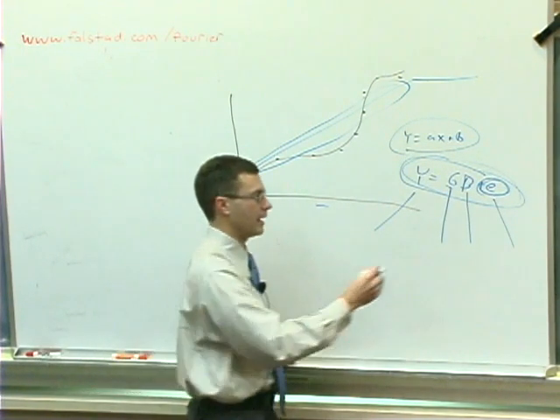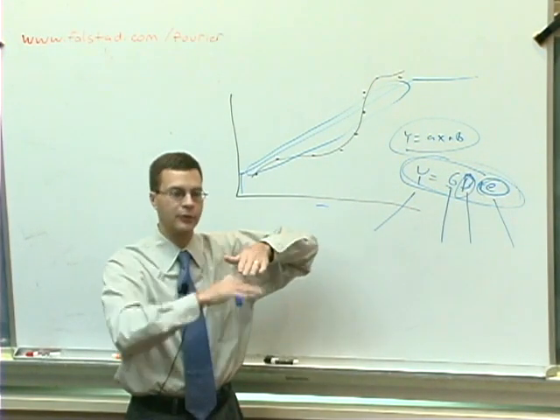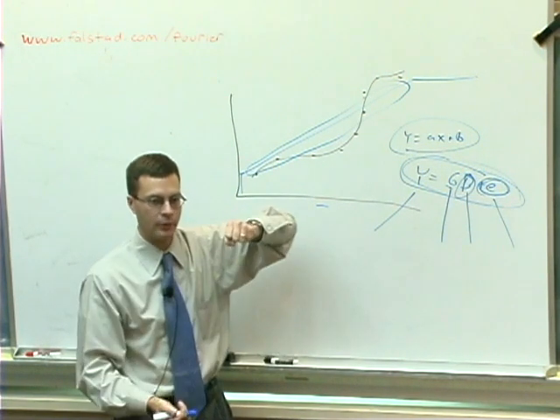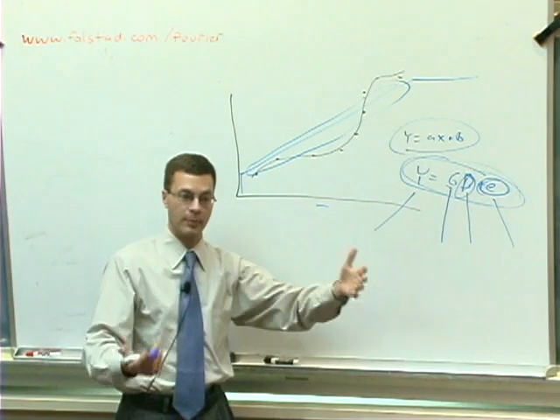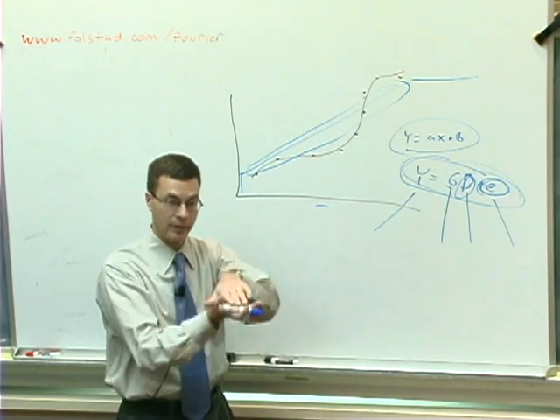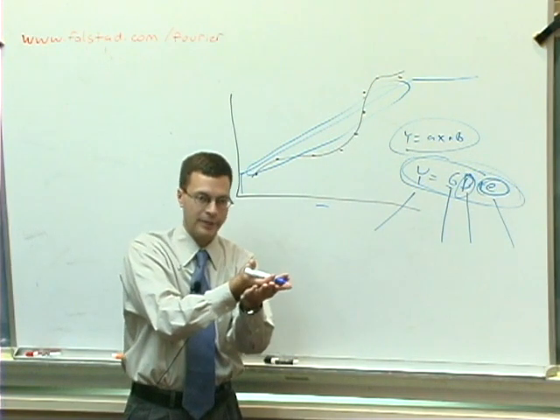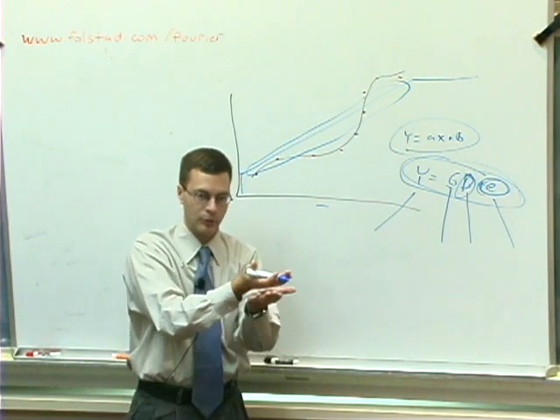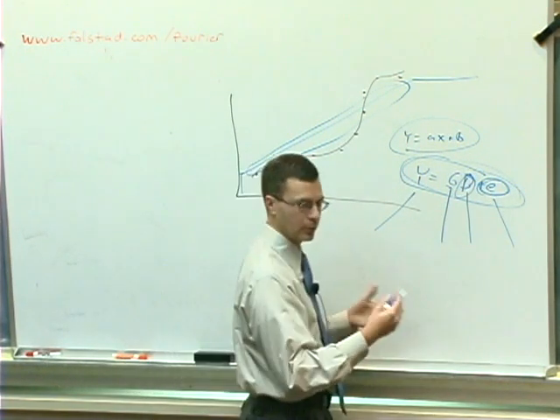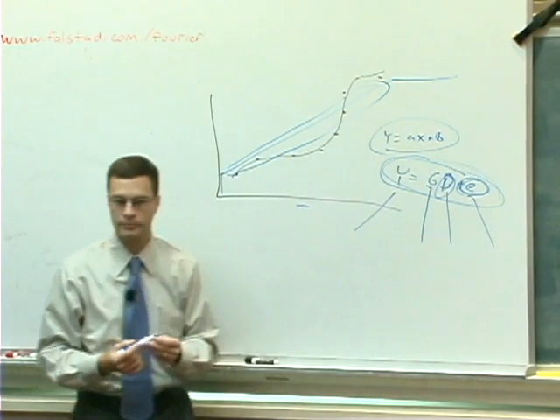Okay, the beta values, as you recall, or perhaps I'll try and explain again, it was the amount of scaling, how much you had to stretch those covariates up or down to make them fit the data as best as you possibly could. So sometimes for some effects you might have to stretch them up real big to fit the data. Sometimes you might only need to stretch them up a little bit. Sometimes you might even have to flip them around and make them negative. You'd have a negative beta value because neuronal activity actually decreased during a given experimental condition as opposed to increased. So this beta value is free to vary, but ultimately the statistical significance of your result is dictated by the ratio of the beta value to the E or error term.